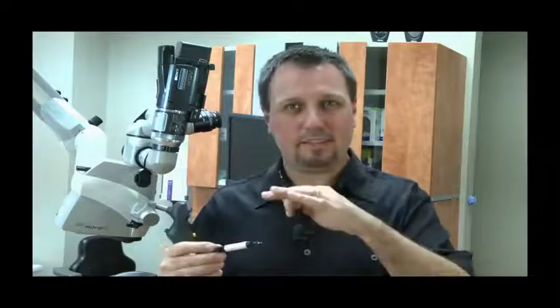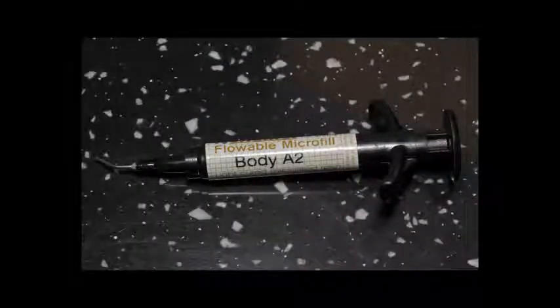I use a filled adhesive, such as Single Bond is the adhesive that I use in this case, which is a quality filled adhesive, which gives me a fairly thick layer of adhesive. And I use Renamel Microfill Flowable. And I use this because this, combined with the adhesive, tends to give me a really good, long-lasting result. This flowable microfill flows nicely into these class 5 defects, and I find I can manage the defect really well. It handles well in these situations and flows nicely without flowing too quickly. And it also polishes really well and holds its polish well enough that I have a good long-term result that's healthy with the tissues. So let's look at the video that I filmed with the microscope.